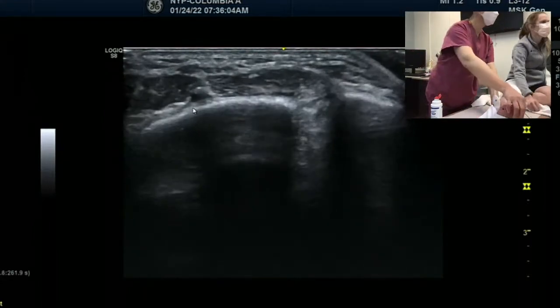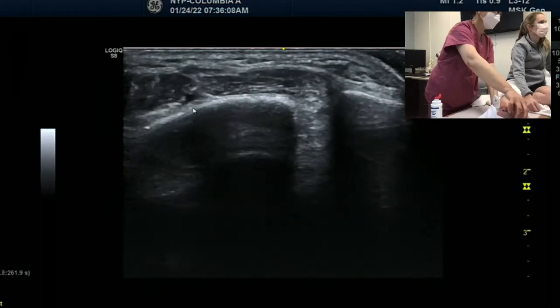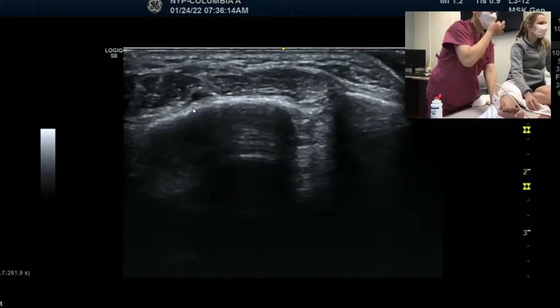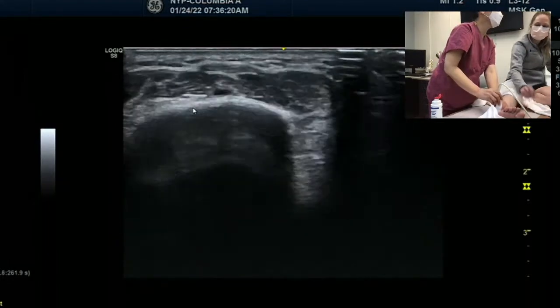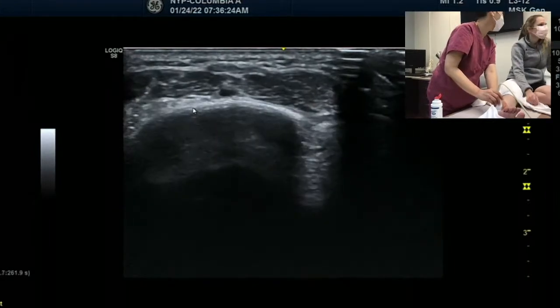So now she's going to move over the EHL. That's the EHL. We can do the EHL, but we don't need to do it here because that's not the motor point area. But for the nerve conduction study, for deep peroneal nerve conduction, it's 8 centimeters. So we go 8 and 14 today.